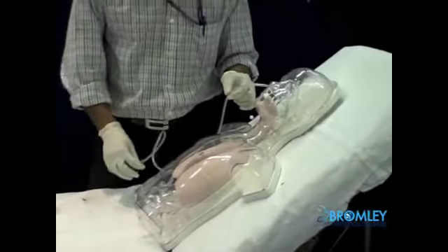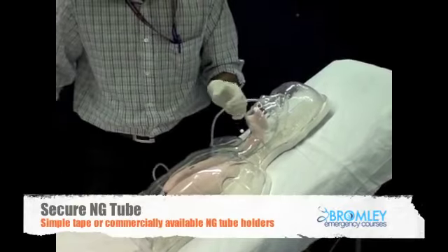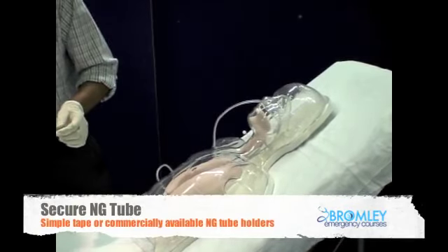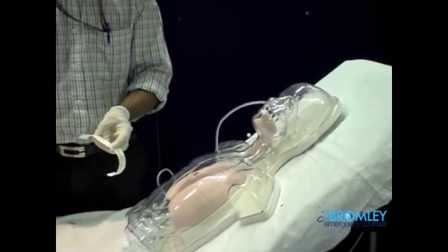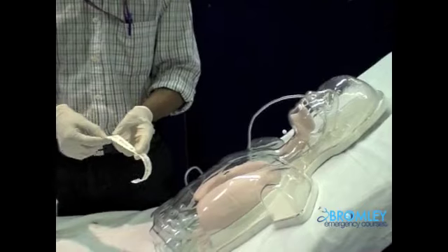So we inserted the NG tube, we need to secure it. There are different ways of securing. One way commonly used is you can use elastoplast or MFX.